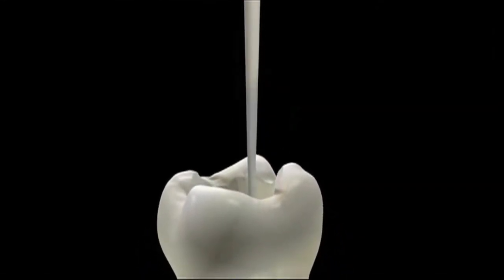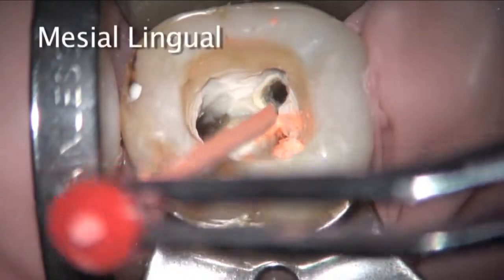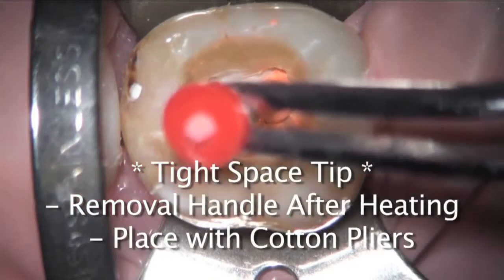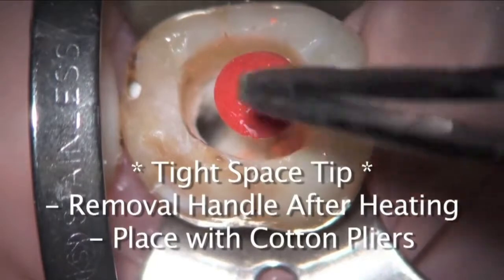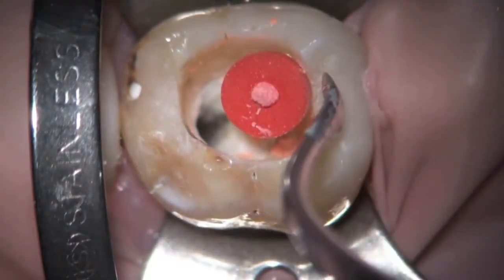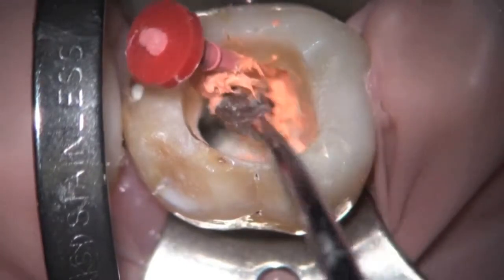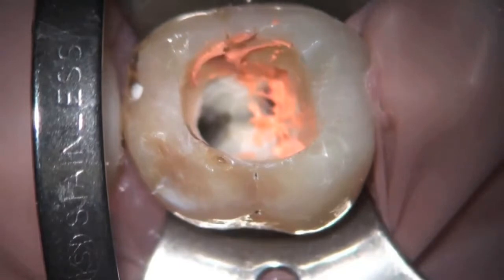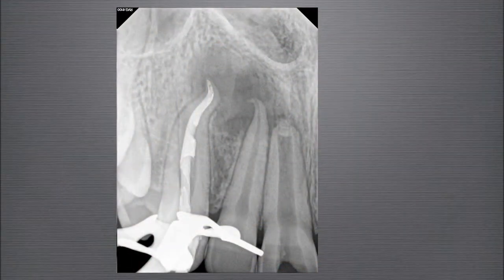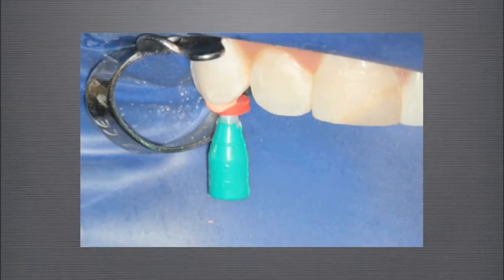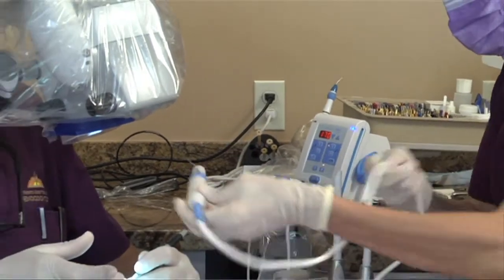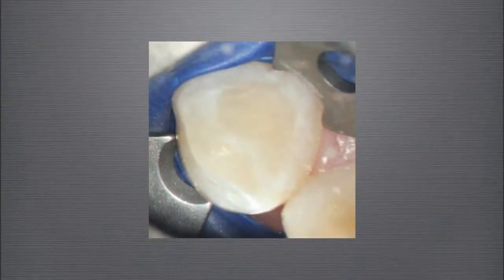Sealer was placed in the canal using a paper point, and a number 35 GuttaCore carrier was inserted into the canal. A PA radiograph was taken to confirm obturation. Note some voiding in the apical area, as well as the mid and coronal third of the root. This was a result of a very large canal, which required more gutta-percha. To resolve the voiding at the apex, moderate finger pressure was applied to the carrier handle for one minute in an apical direction. I then used my Calamus Dual to create space next to the GuttaCore carrier, and subsequently added more warm gutta-percha. The tooth was restored, and here is the final result.